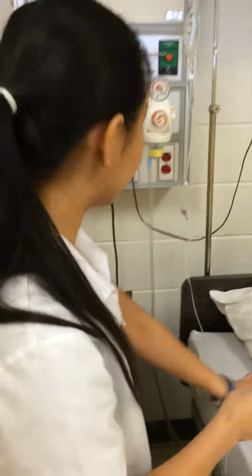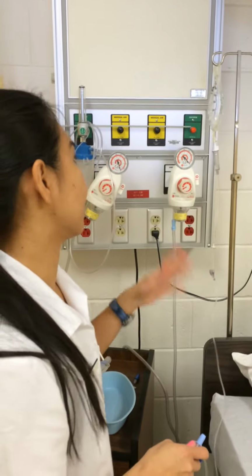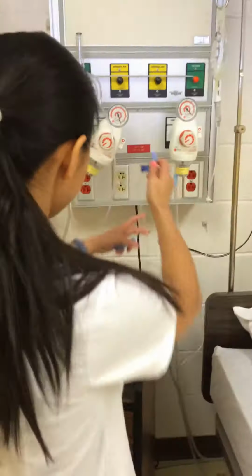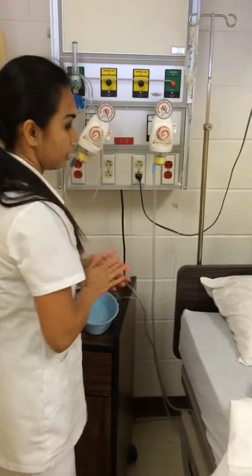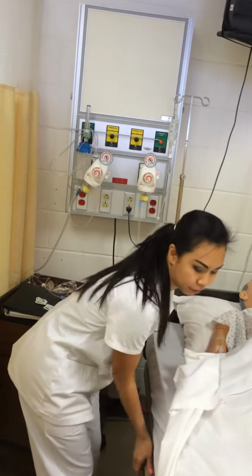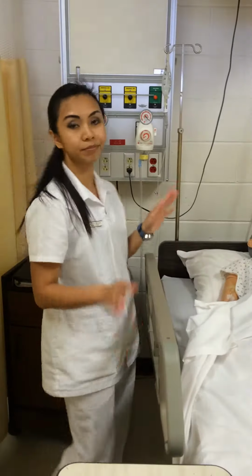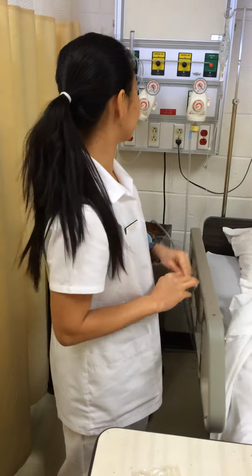So after I connect it, I just unclamp it, and the patient will get the IV at 60 drops per minute. So before I leave, I make sure the patient is comfortable, bed rail up, and in the lower position, and I document it.